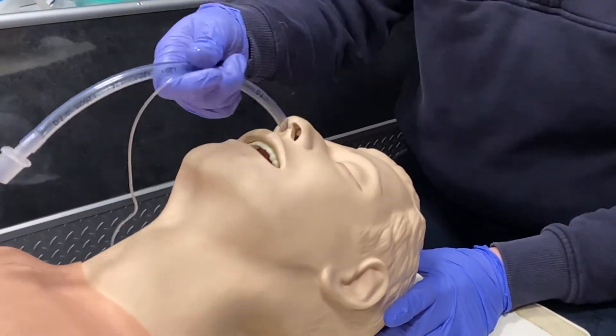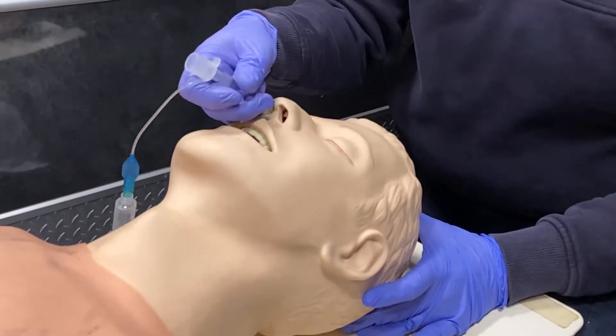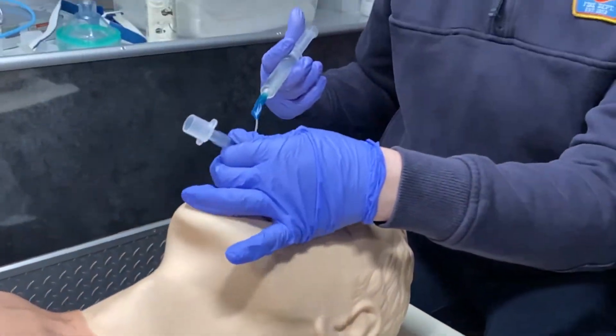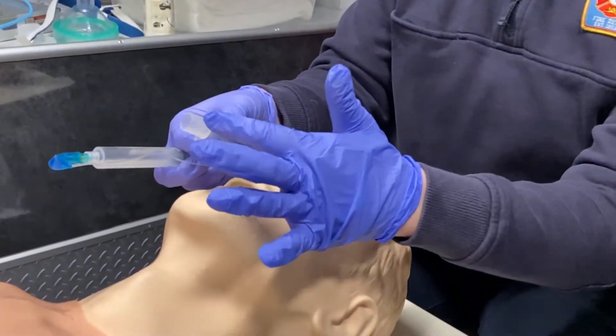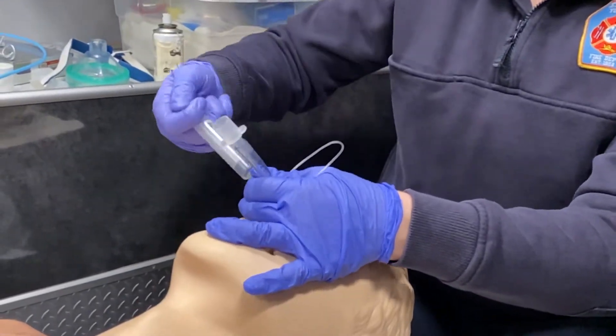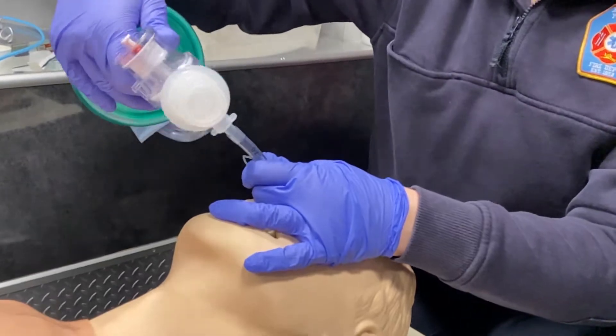You're going to insert this just like an NPA. Put the patient's head in neutral position and you'll feel it stop moving. I have seen these go all the way down to the connector — you could end up in the right main stem if you do that, but you would just pull back a little bit, so that's okay as well.